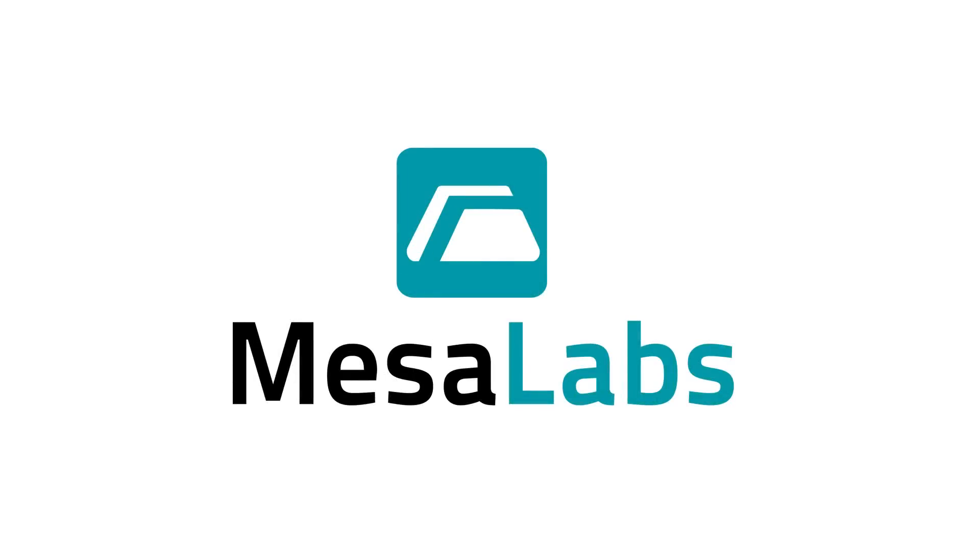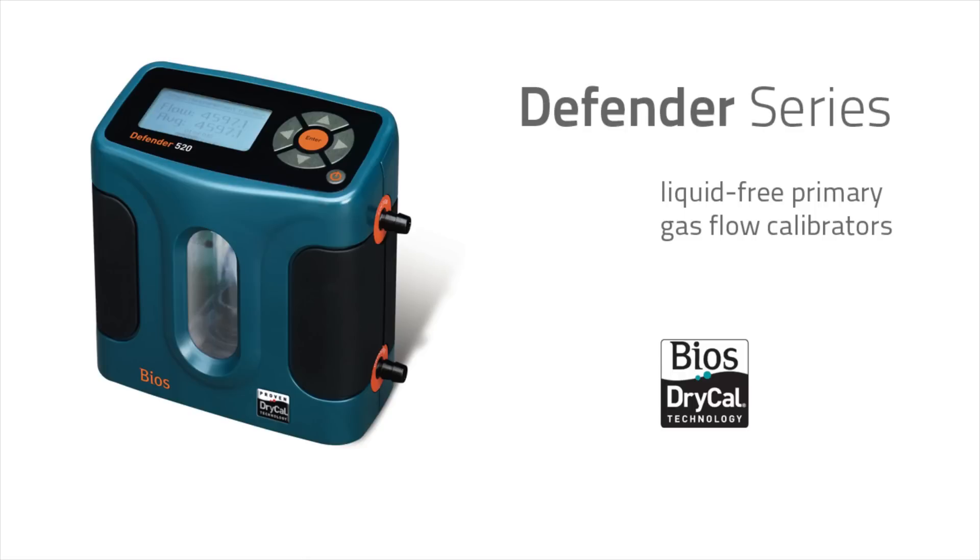Today we're going to show you some of the features and functionality of our Defender Calibrator series. Our proven DryCal technology is a primary liquid-free gas flow calibration standard that doesn't rely on messy soap bubbles or other liquids for measurement.